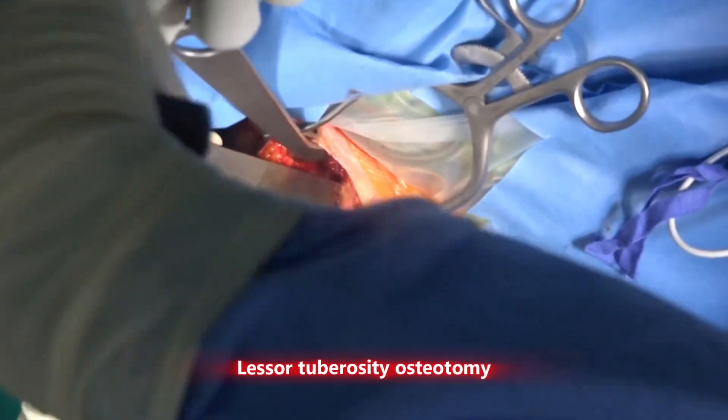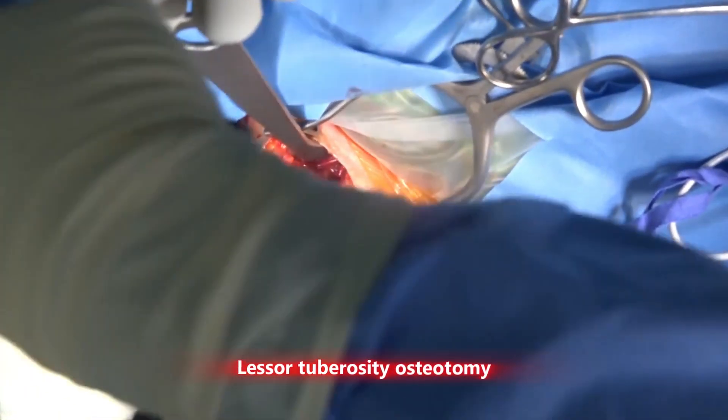With LT osteotomy, we can aim for bone-to-bone healing of the subscapularis.